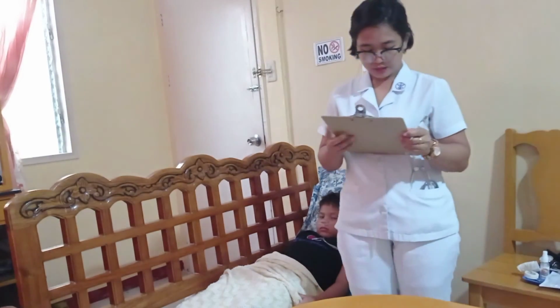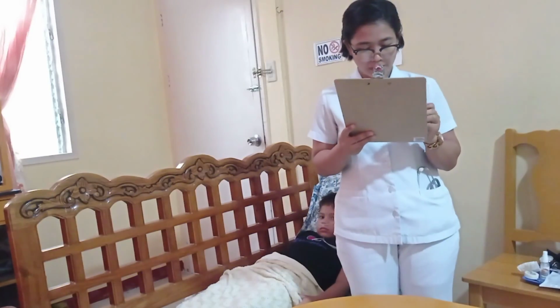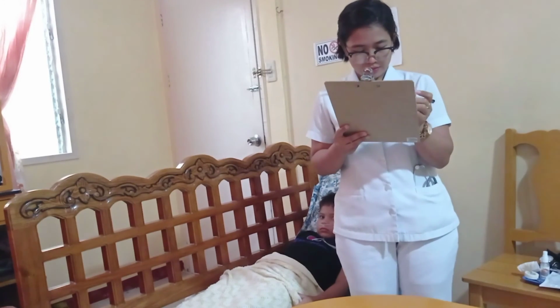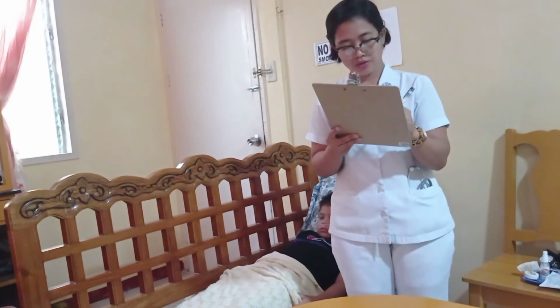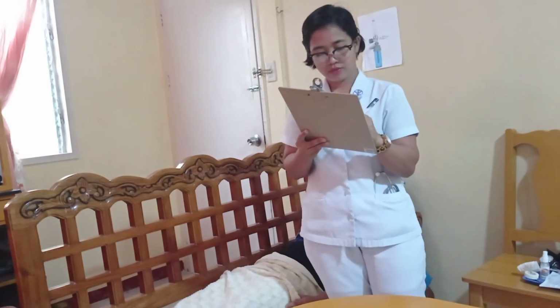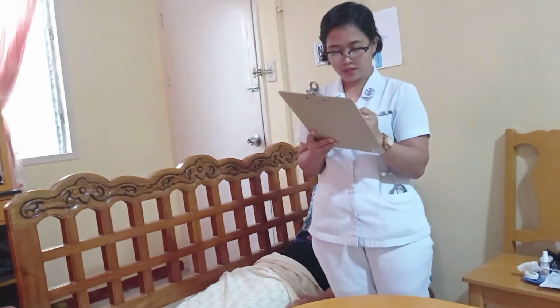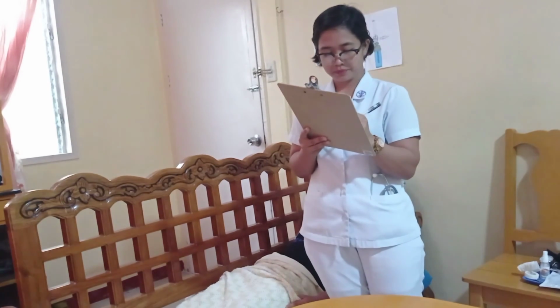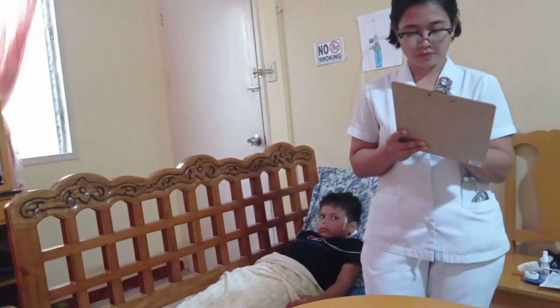And there are no signs of cyanosis, hypoxia, or difficulty of breathing, and no irritations found on the skin of our patient. And that would be all of my procedure. Thank you.